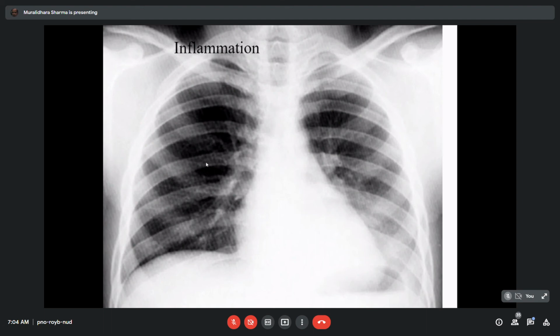and then the lung tissue. In the lung tissue too, you will have to comment on each segment or each lobe of the lung tissue, hilar areas. These have to be noted. Diaphragm also, the surface of the diaphragm also has to be noted. So whatever details you see, they have to be noted down. And at the end, you will come to a conclusion like the pathology is bronchitis. So in this case, it is the bronchitis as such.